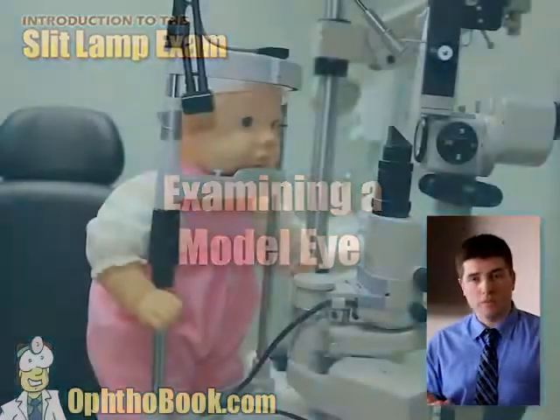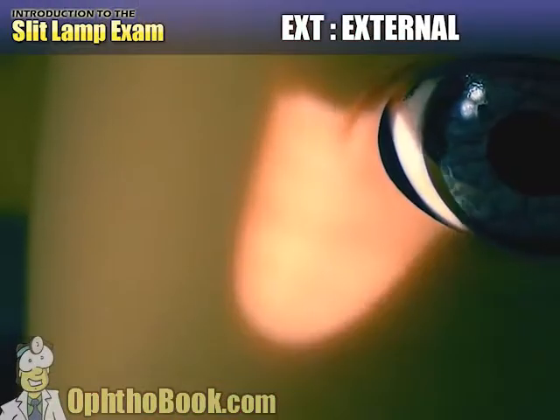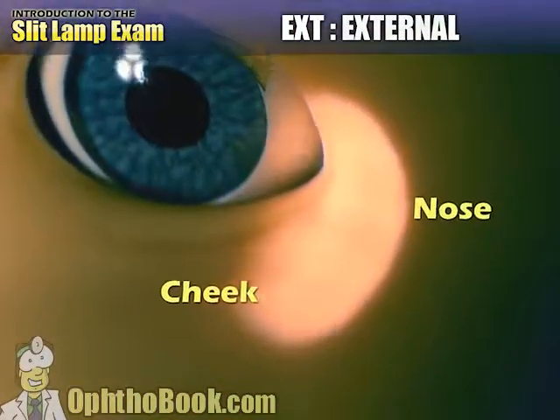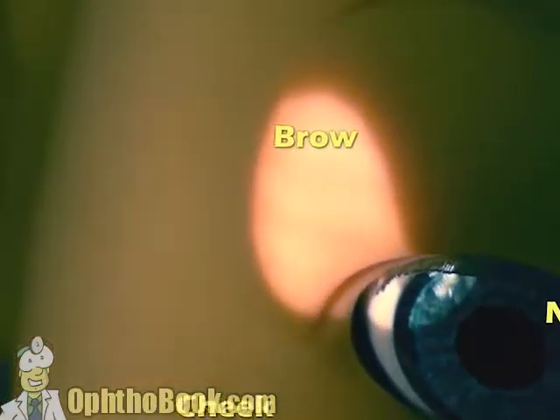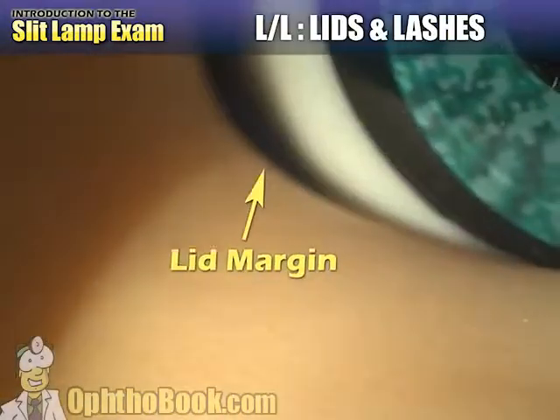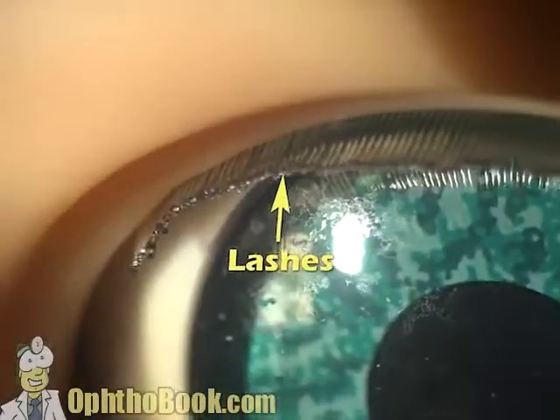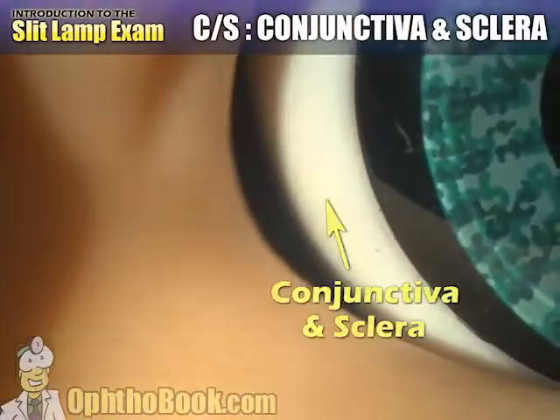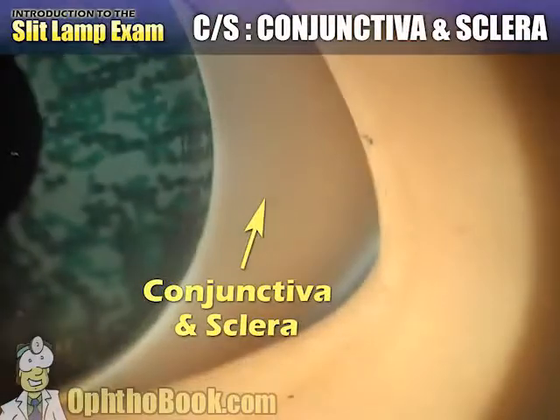We're going to move on to a model that's a little bit more anatomically correct. We always start with the external eye exam — we look at the cheek, we look at the nose, we look at the brow — things around the eye that might cause ocular problems or be related. Moving on to our lids and lashes, we always look at the lid margin and the lash line. Moving on to the conjunctiva and sclera, the white part of the eye — white and quiet here.